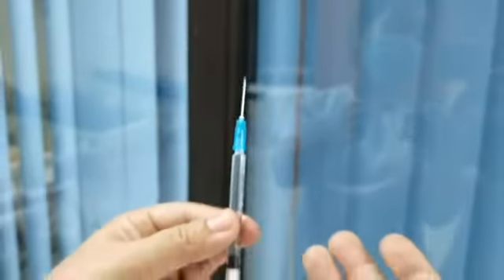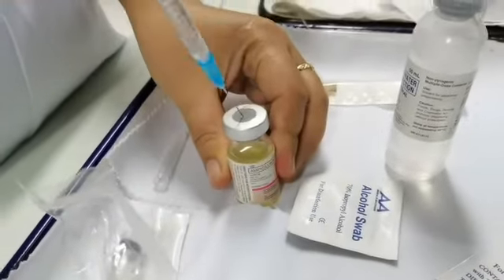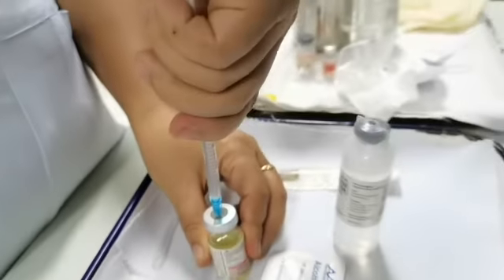So then after that you get 0.1 ml of reconstituted antibiotic. So still holding the plunger like this, you inject the needle slantly, and then like this, still holding the plunger.